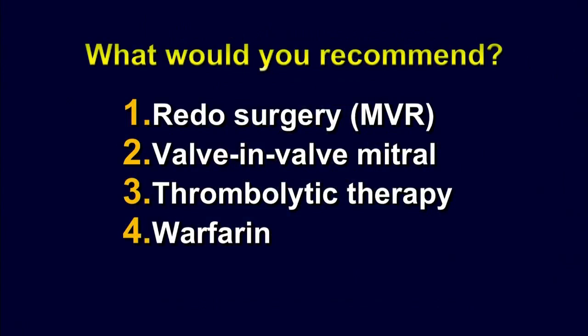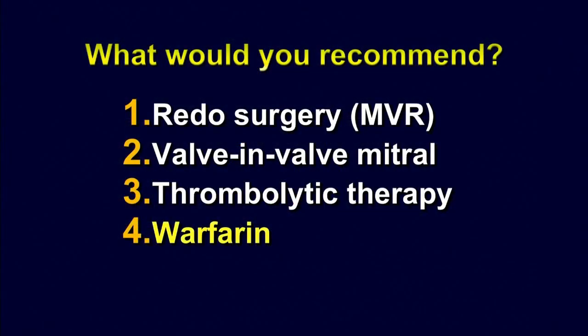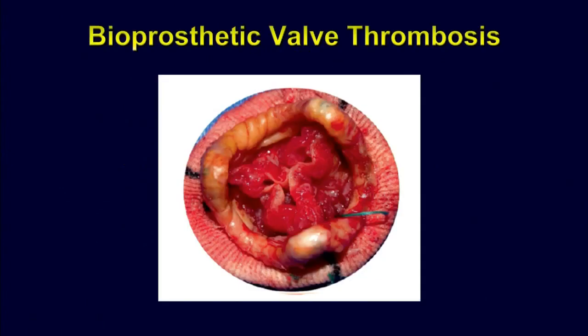Should we redo surgery, valve-in-valve mitral, thrombolytic therapy, or warfarin? And for the interest of time, I suppose we can see that most people, well, a pretty even split, I guess only 2 or 3 votes here, but warfarin wins, and that's probably the correct answer, that we would consider warfarin therapy.